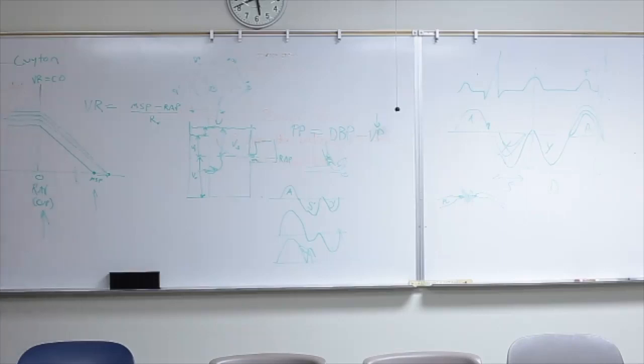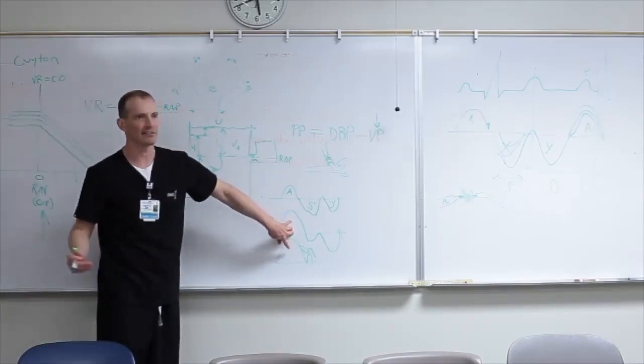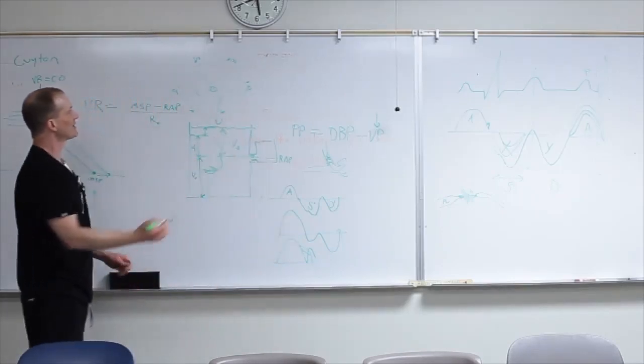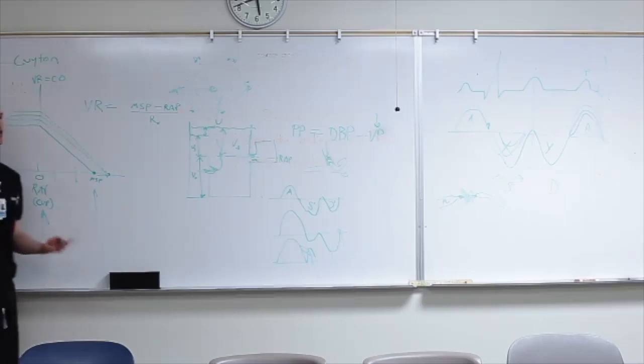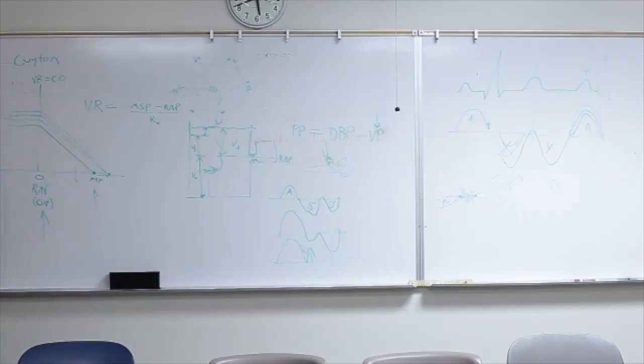Right? Okay. So if our pressures backing up into the hepatic veins up through these sinusoids get high enough, it's actually going to press and push back through the portal system. Okay? And the portal pressures are going to start getting high. Okay? And we can Doppler the portal vein and see that.